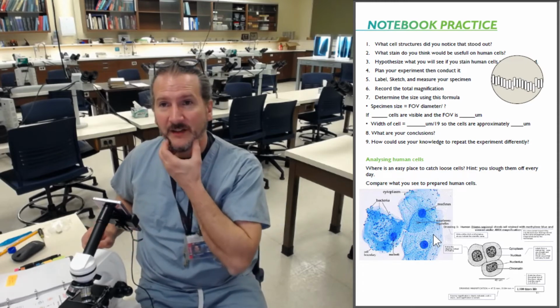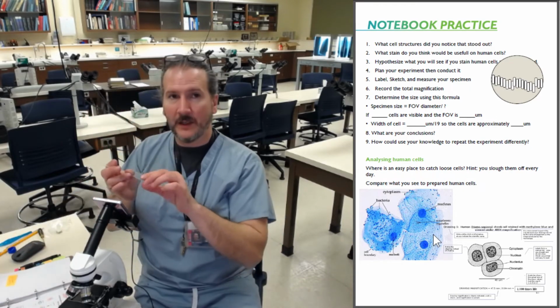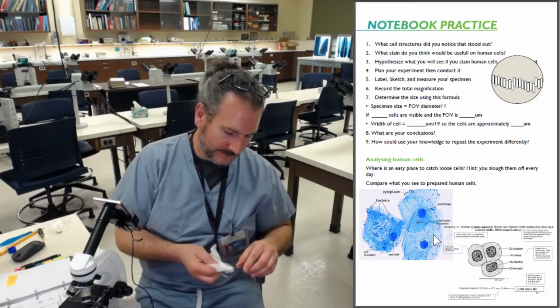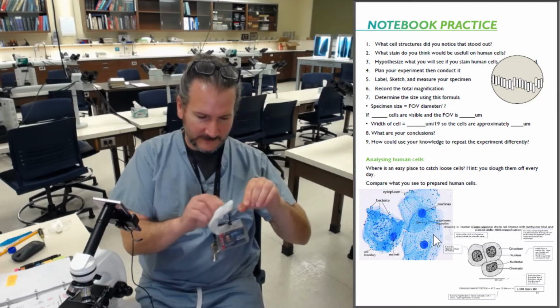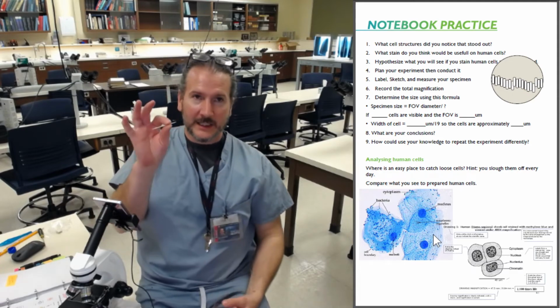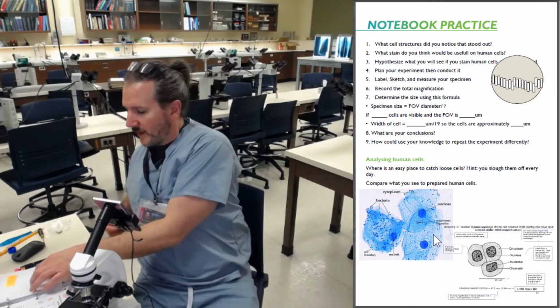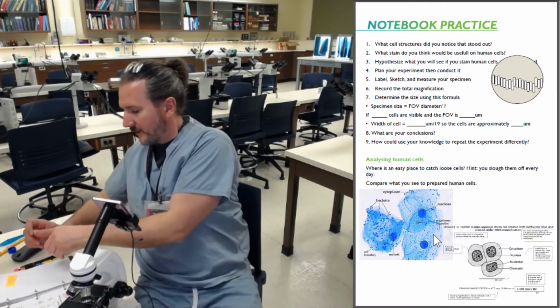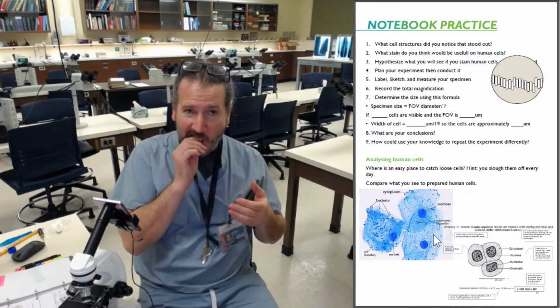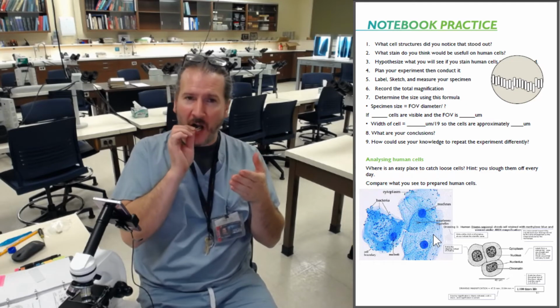So you can see the blue cells there are actually human cells. What you're going to do, you're going to grab a slide. I have a clean slide. I just touched it with my fingers, so I'm going to have to wipe it off now. Got it. Right. Get a clean toothpick. I just got a toothpick out of a box. I've been holding it in my finger here. Put your slide down. You're going to, oops, let me flip the page. You're going to, great, not poke, not jab, these can be sharp. You're going to scrape, push to the side of your cheek and drag down.